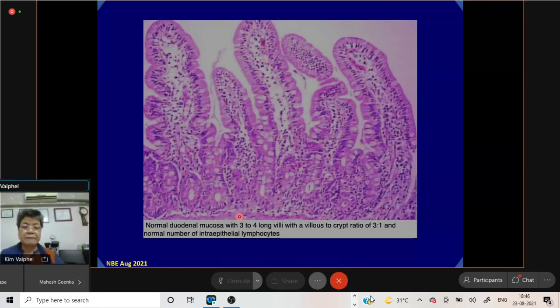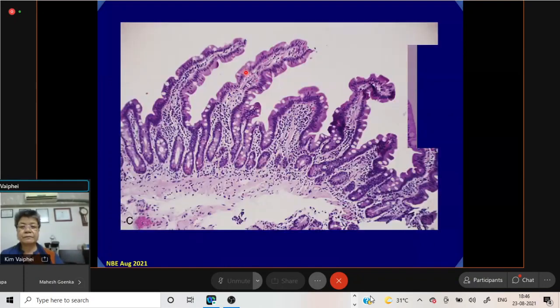And I think with my experience, I can speak very boldly. I think that presence or absence of muscularis mucosae does not tell you whether the biopsy is properly oriented or not. The crypts do. Only then should one say whether the orientation is proper or not. Then only can one go ahead and try to interpret crypt-villus ratio or stunting of the villi, not otherwise.